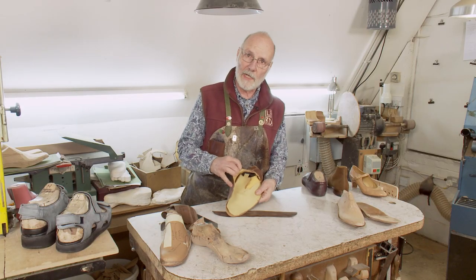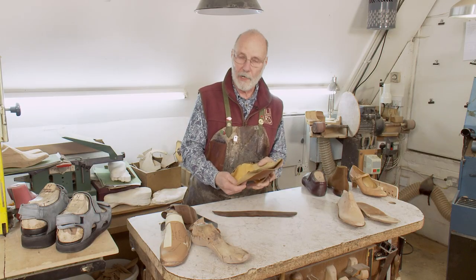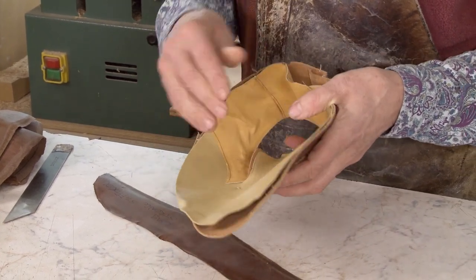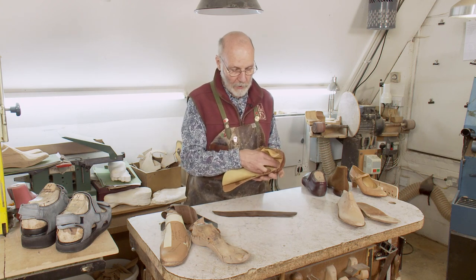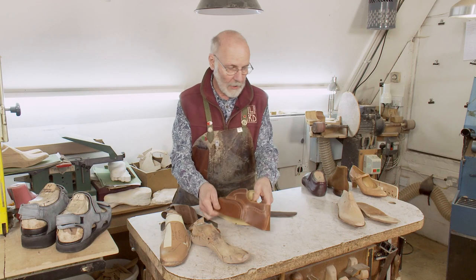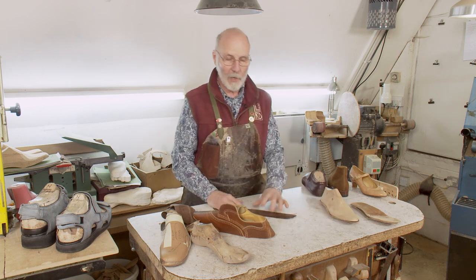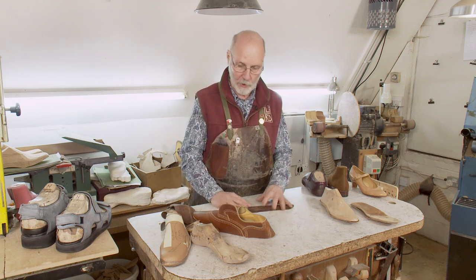Even the lining you can see when you take the shoe off. A lot of people try to cut corners by putting cheap linings in. But with ours, we have very, very good quality leather linings. What can't be seen is when we put something between the lining and the upper, or between the sock lining and the sole. All of this stuff is hidden, but it is probably some of the most important elements of a bespoke orthopedic shoe.